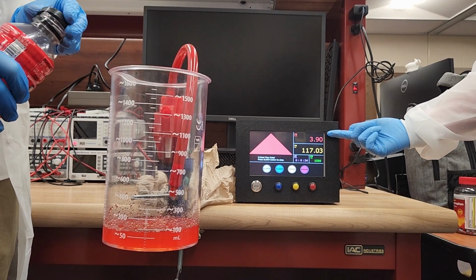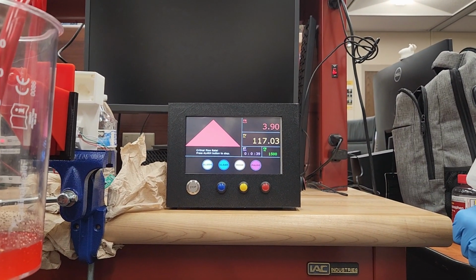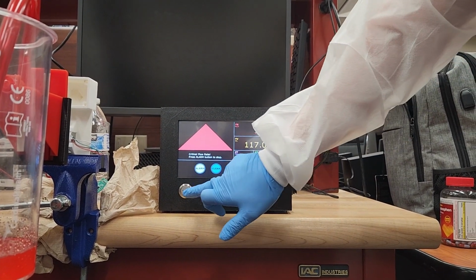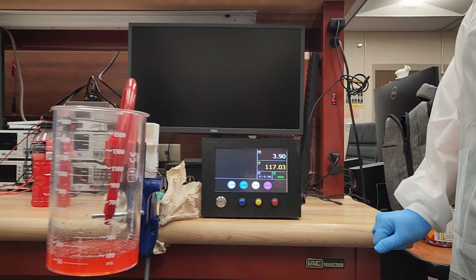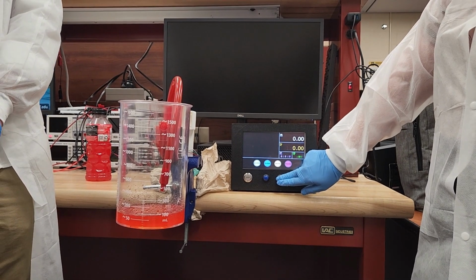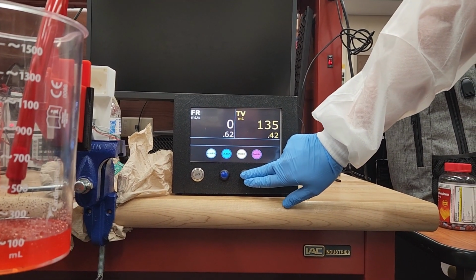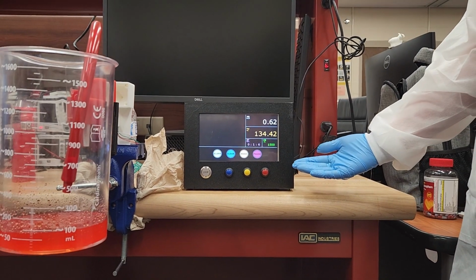The blood flow rate has exceeded, so our alarm has alerted, and I can disable the alarm sound with the alarm button here or here. Next, we can toggle through the mode of the screen by pressing the mode button. Here you see different views. I've returned to our main screen.